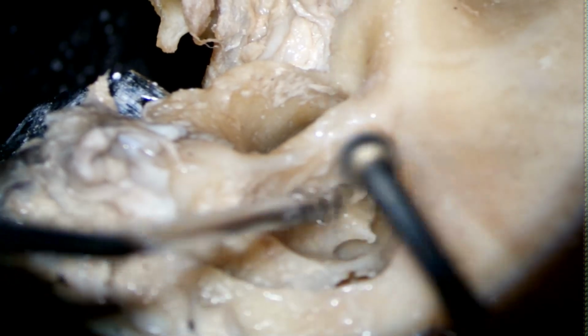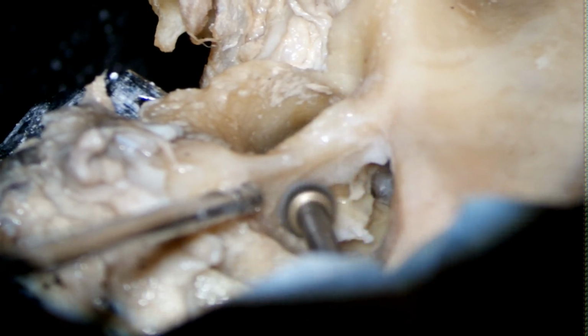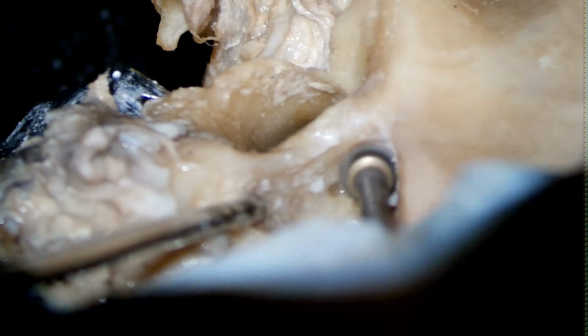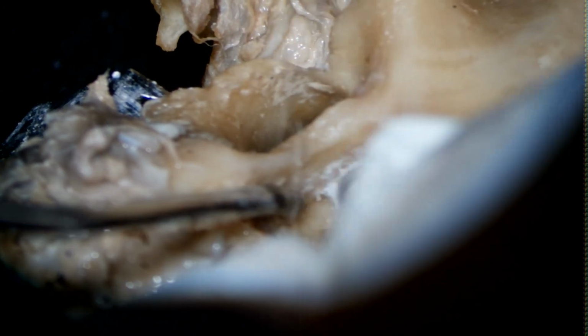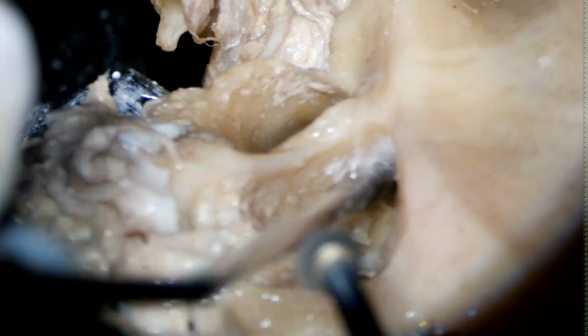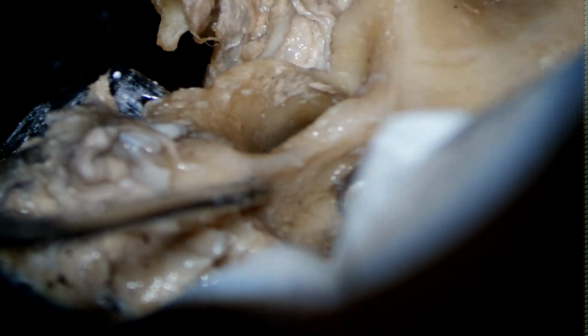And we can drill anterior to the facial nerve. These are all mastoid cells.